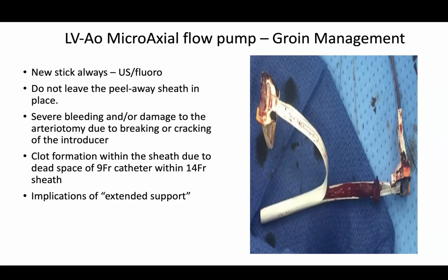We can do that. What I've been doing, and I asked Chris if I could do this, is if I'm dealing with someone with shock, I'm not putting a balloon pump in because it delays transfer. So I just try to fix the vessel and get them out. It hasn't happened that much, but it's happened.